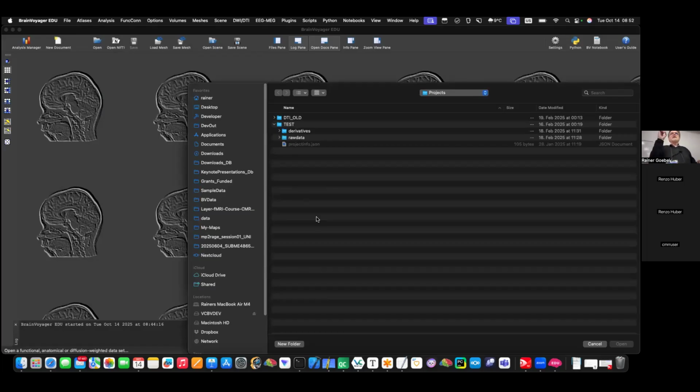If the file cannot be selected, type asterisk dot asterisk, or you rename it to edu_x dot bin, because it looks for exactly that name. But if you search for asterisk dot asterisk, that's actually better. Then you don't have to rename your files.